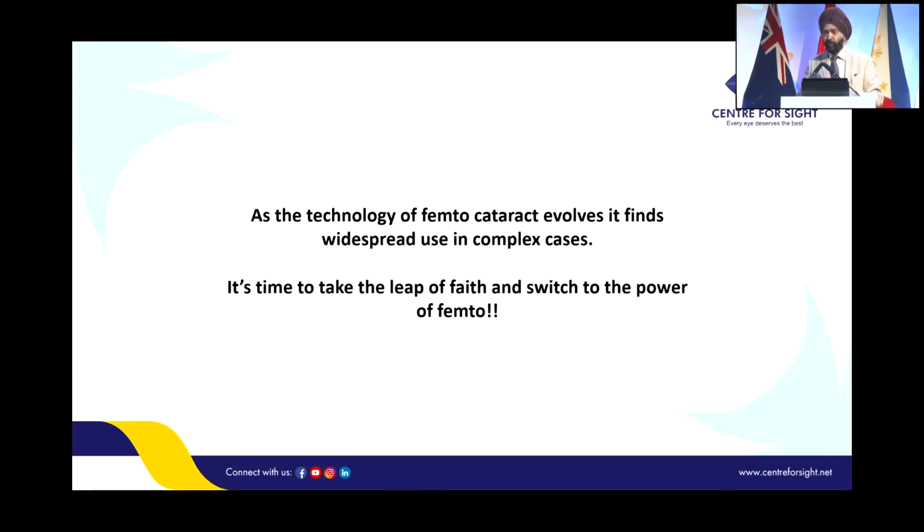So friends, these are a couple of the cases which I would wish to bring out to you. Femto as a routine is fantastic, but the bar goes up the moment you are looking at difficult cases. Some of these difficult cases I have shown you, where even if I have to pay from my pocket, I will ask the patient to definitely go in for a femto laser procedure, because as the technology has advanced, it has really taken the complex cases to a different ease. And friends, I would say it's the time to take the leap of faith and switch over to the power of femto.